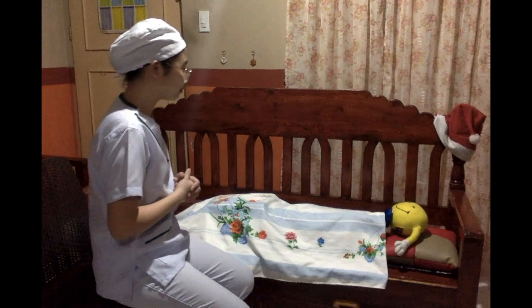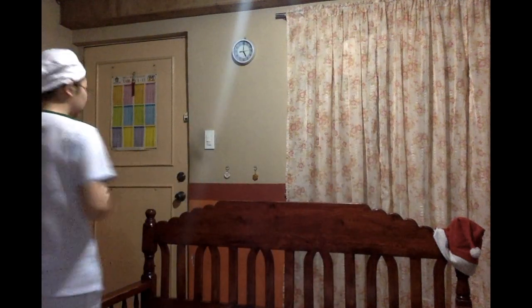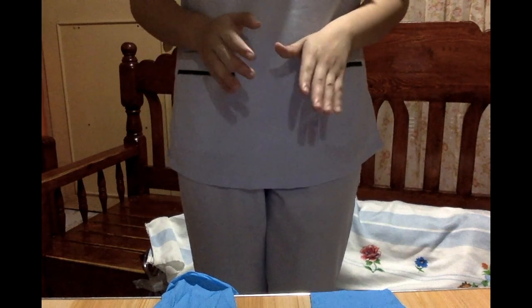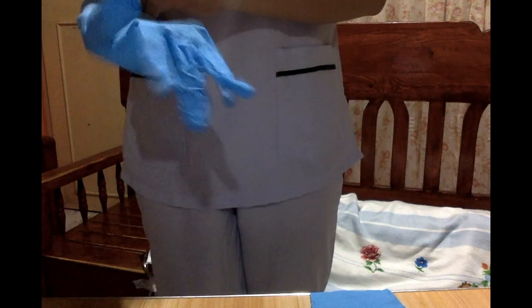Opo, kahit ano po. Provide privacy to the patient by closing the curtains and the door. So this maintains client's dignity and lets the patient be comfortable during the procedure. I will now don non-sterile gloves to prevent microorganism transfer and exposure to patient's body fluids.